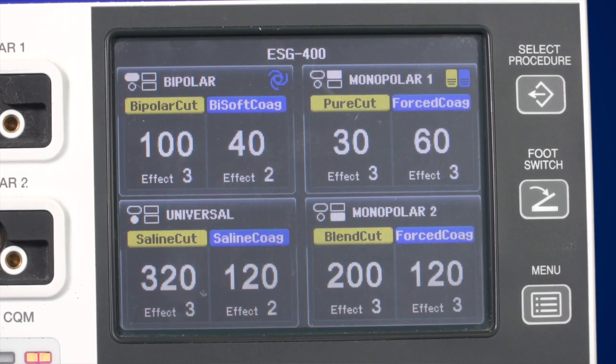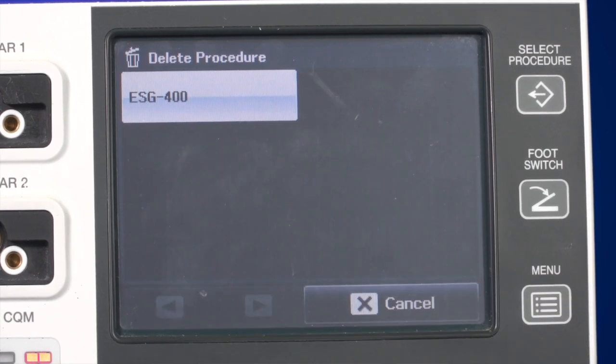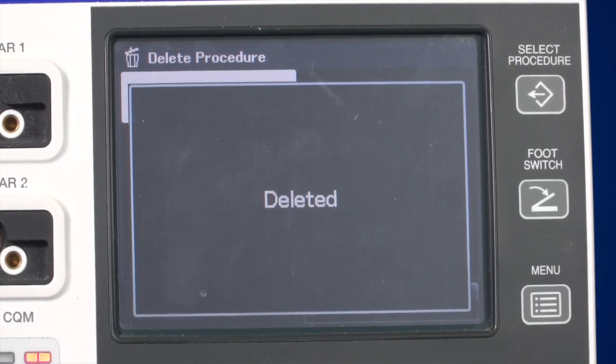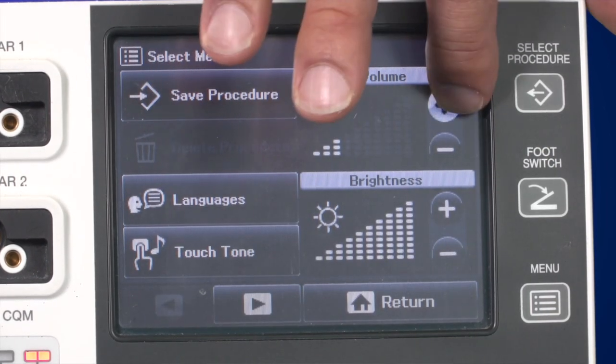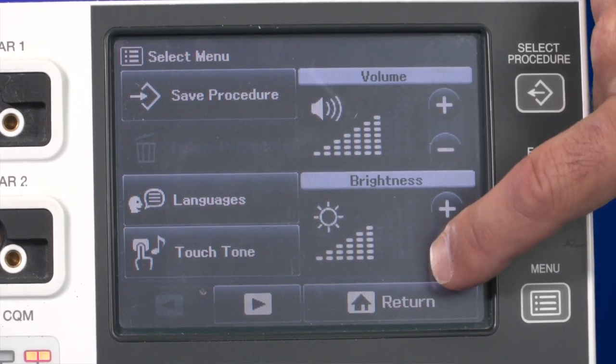If you want to delete a procedure, press the Delete Procedure button in the menu, then after selecting the procedure, confirm that you really want to delete it. On the menu screen, you can also adjust the volume and brightness level depending on your surroundings and personal preferences.